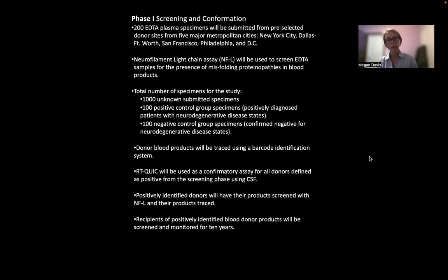In phase 1, the screening and confirmation, there's going to be 5 pre-selected donor sites from major metropolitan areas, and each will submit 200 unknown specimens from each site, totaling a number of 1,000. There's going to be 100 positive control group from positively diagnosed neurodegenerative diseased patients, and also 100 negative specimens for our negative control group from confirmed negative patients.